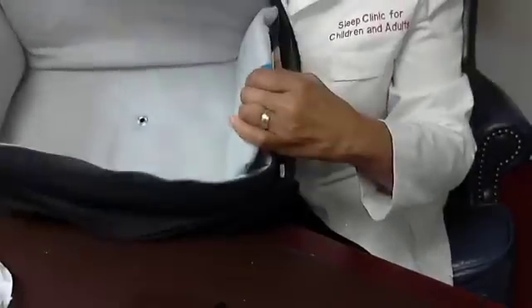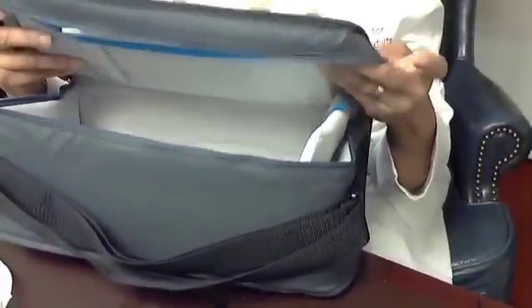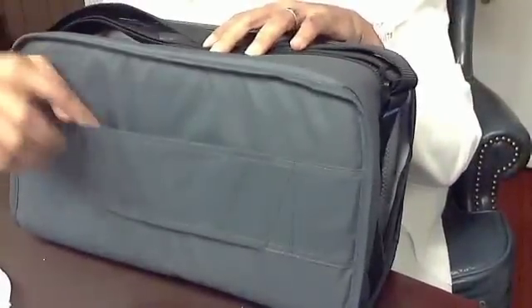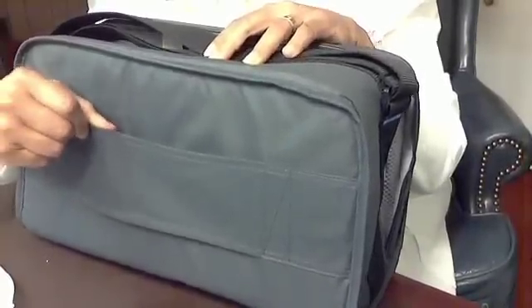Here's the bag — it comes with a padded inside and a little netting where you can put your manuals. This is also a good place to put questions you have for the respiratory therapist, your sleep specialist, or your primary care doctor. Just write your questions on a piece of paper and drop it in here, then bring it to your appointment. There's a strap for over-the-shoulder carrying, and another strap to slip onto luggage handles to make carrying easier.